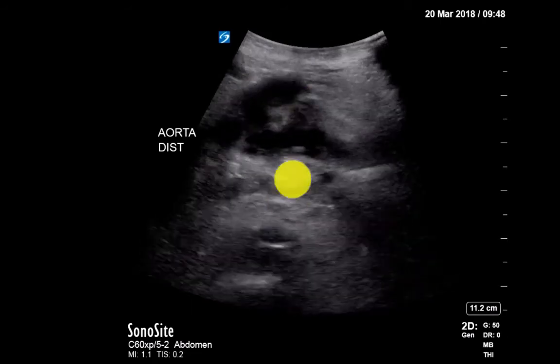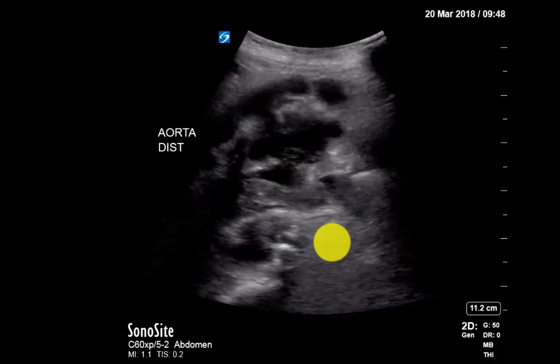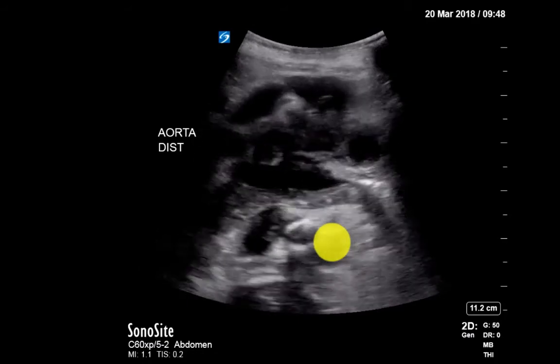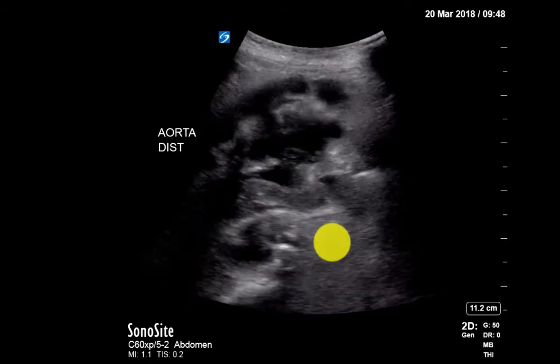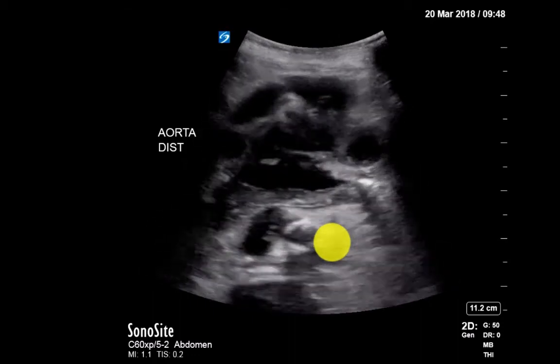They ran her through the CT scanner and confirmed this, but with the use of some Doppler, they were able to kind of troubleshoot this and say, okay, well, we still need a CT here, but we don't need to hit all the bells and whistles here.